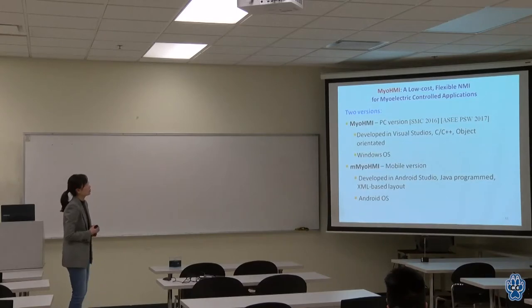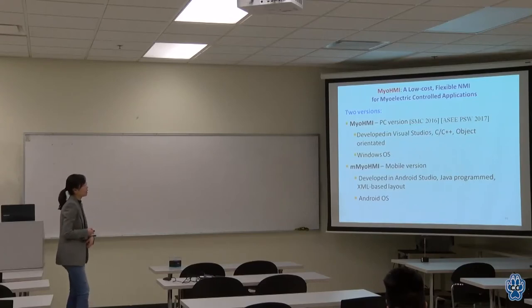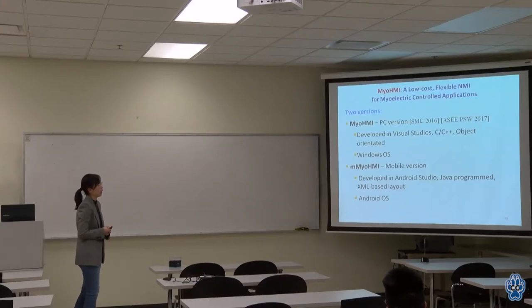So far we have developed two versions. One is a PC-based version, which is just called MyoHMI. We have a few papers published based on this implementation, and it's developed using C and C++. It's running on Windows operating system. And a mobile version that is developed in Android Studio, so now it's an Android-based portable version of the MyoHMI.